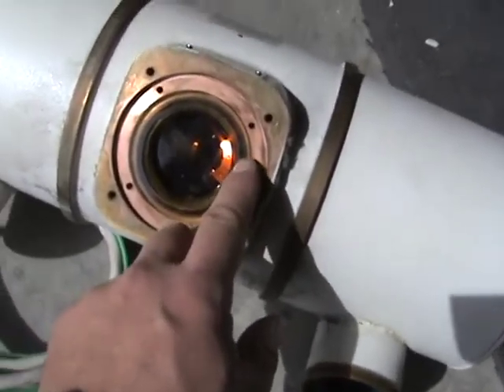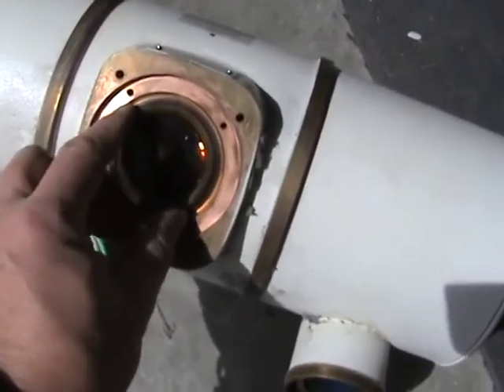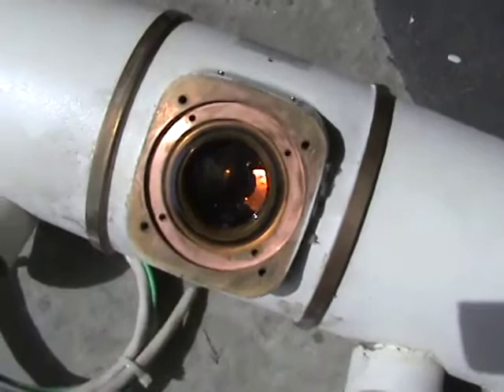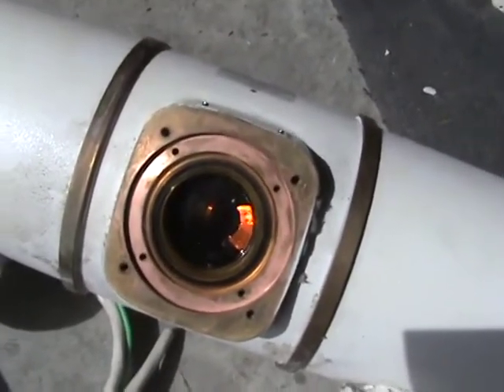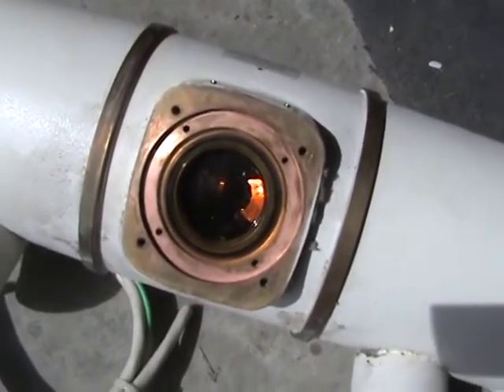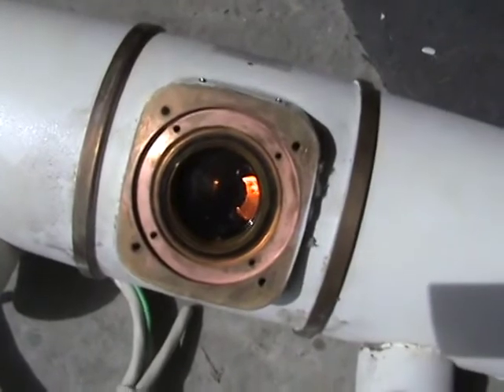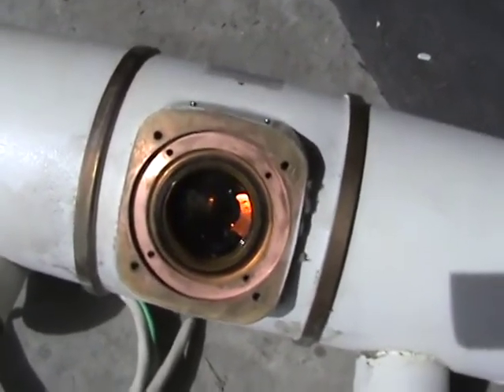We're kind of in dangerous territory now because I've taken off the retaining ring. I can see that rubber O-ring there - as soon as I break that seal, this tube is full of oil and it's going to be a big mess. So what I'm going to have to do is go get some kind of a catch basin, because I don't want this oil all over my garage floor.